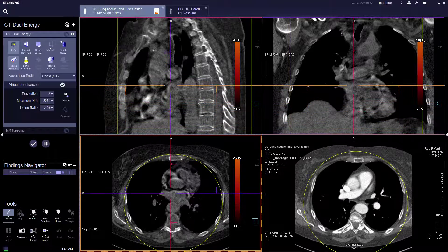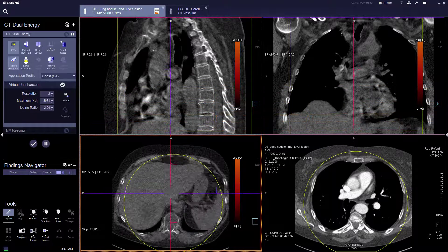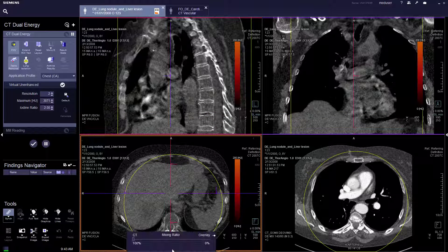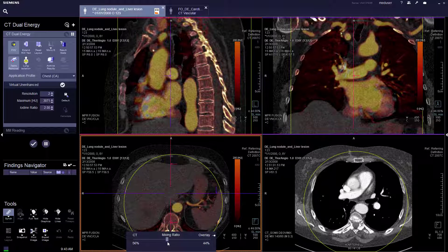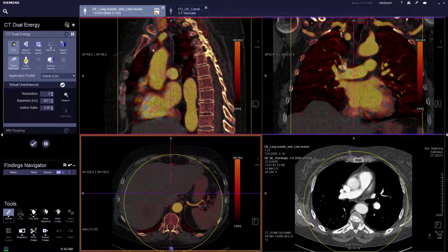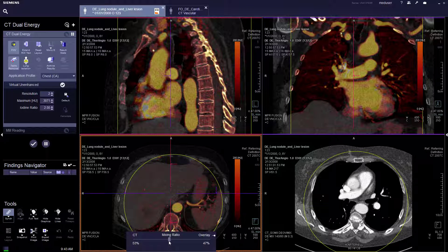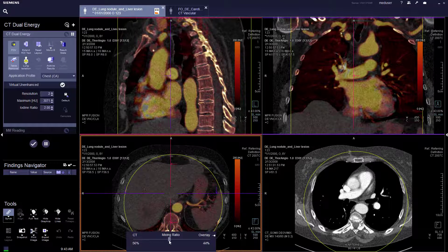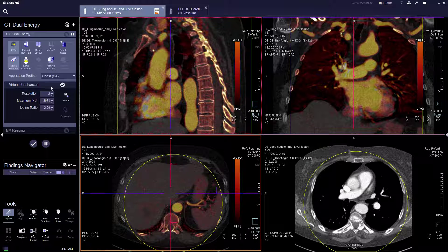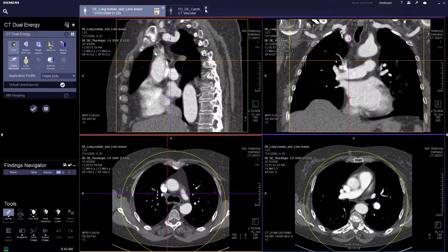Virtual unenhanced can be useful to look at cysts or abscesses to see if there's any contrast filling into the lesion. It's also good for the bladder, where the doctor can differentiate whether there's any contrast present. That covers virtual unenhanced.